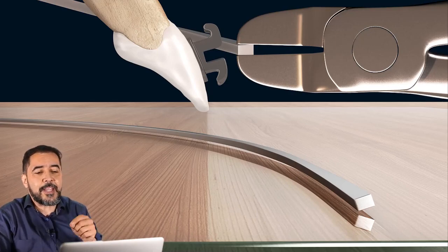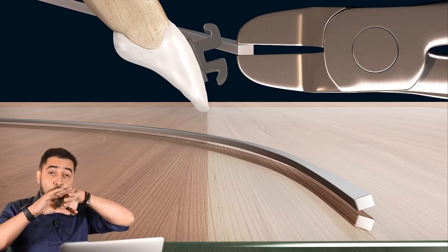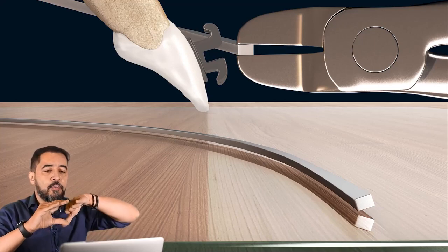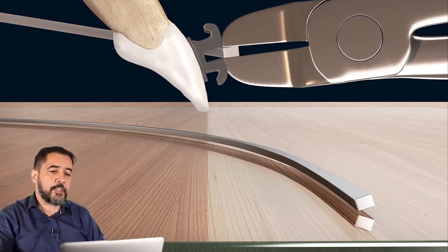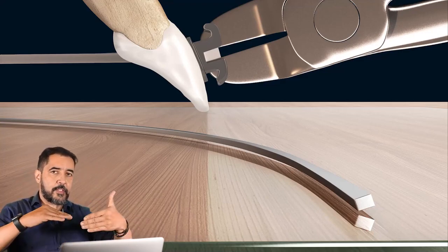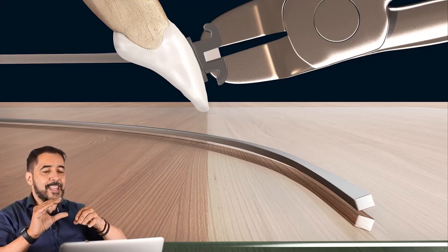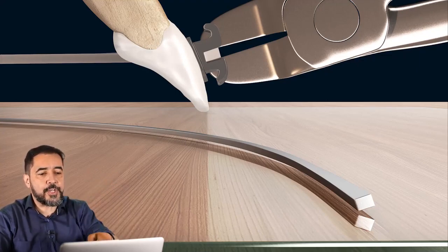So in this case, I have this torsion. I have the real torque, the positive real torque, which has the same sign and the same amount of torsion, of inclination, as the inclination of the slot. So when I put this real positive torque inside the slot, which has a positive inclination, this positive inclination is the same as the torsion I gave here.